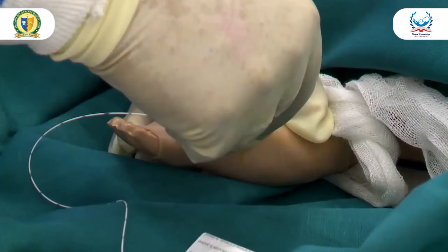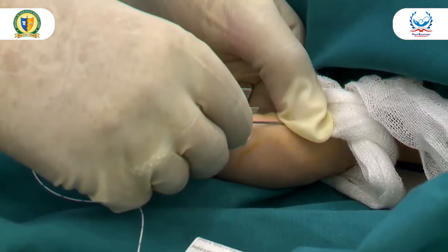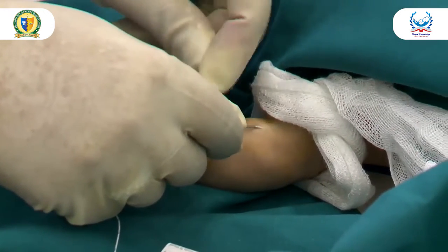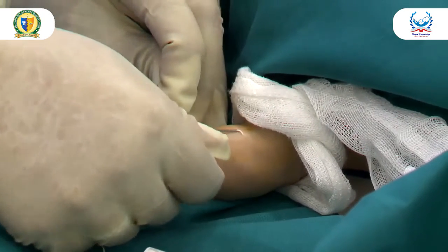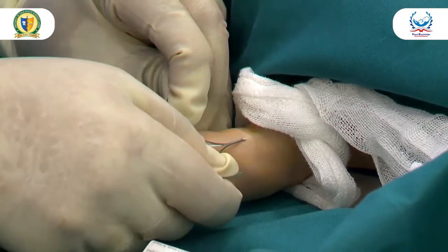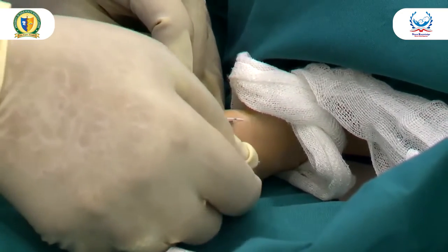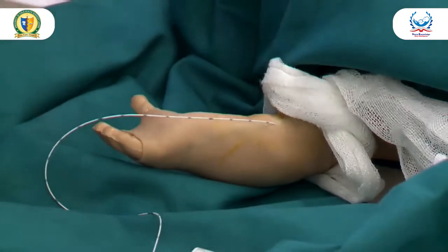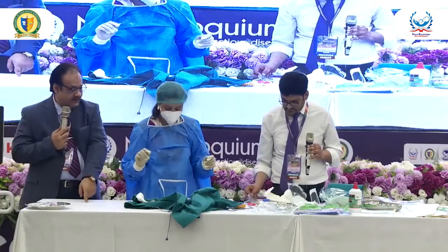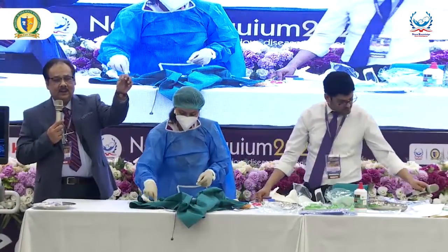First you can pull out the needle and press the insertion site, as Irfan told you, so as not to pull the line back. Then you can break the needle very carefully, because sometimes it can pull the line. That's why Dr. Irfan said to always put 1 cm, 2 cm extra, because during this procedure there is a big possibility that it comes down. As you can see, this needle is now broken down, so it comes out easily.